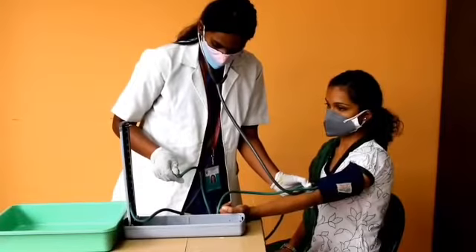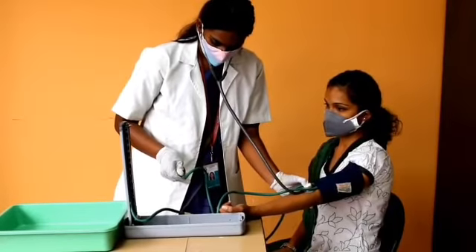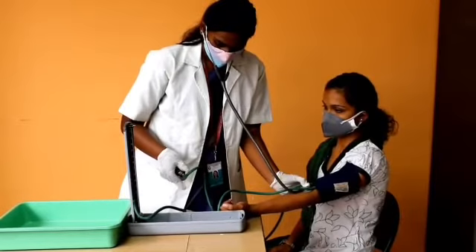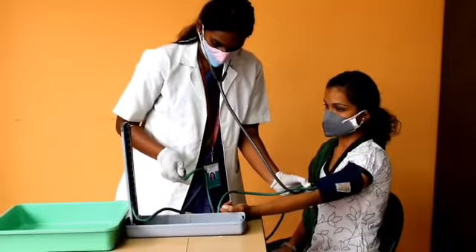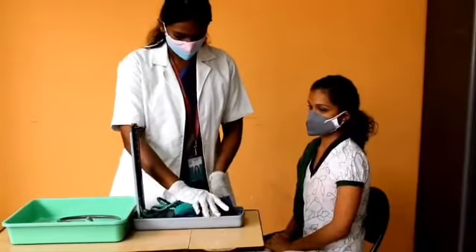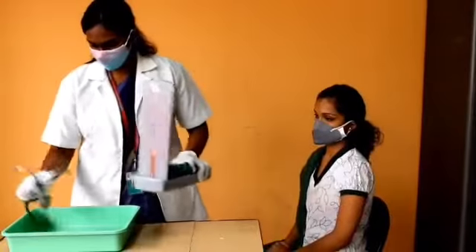Release any remaining air quickly from the cuff and remove it. If you need to recheck the reading for any reason, allow a one-minute interval before taking blood pressure again. Remove the BP cuff, replace the articles, wash the hands, and record on the TPR chart.